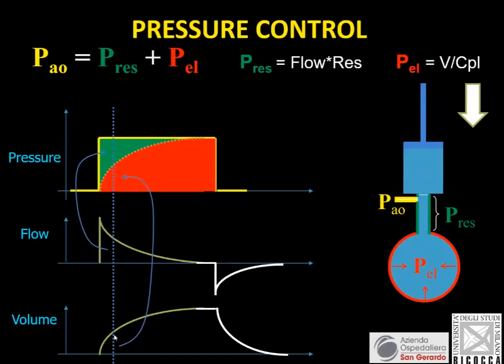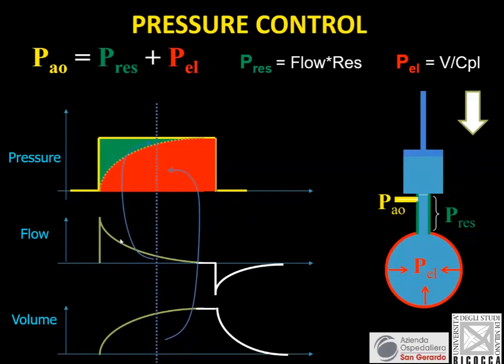It is transformed. It becomes a volume which is distending the alveoli. And so the gradient between the alveoli and the airway will become smaller. And so the flow will decrease and decrease and decrease. There is less pressure that the ventilator can spend in generating flow because more pressure is spent to keep the alveolus expanded.